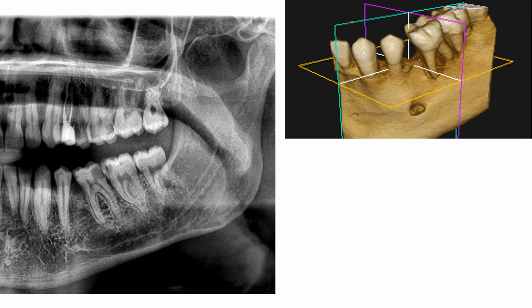This is a mandibular molar with a large carious lesion distally. Periapically it doesn't show anything. It's a very clear picture. Lamina dura is very nice, and really it's quite indicated for endodontic treatment.